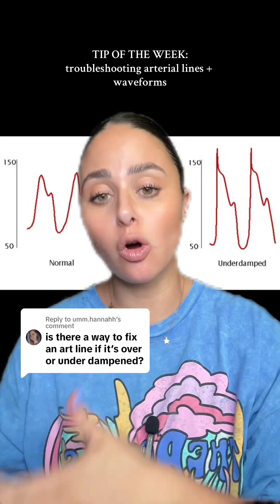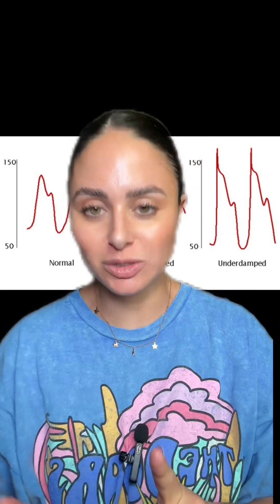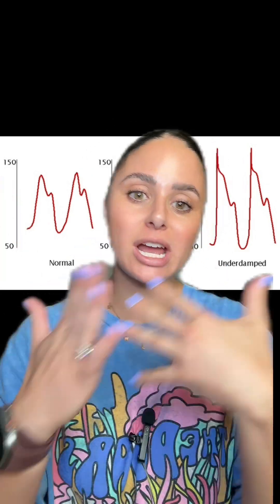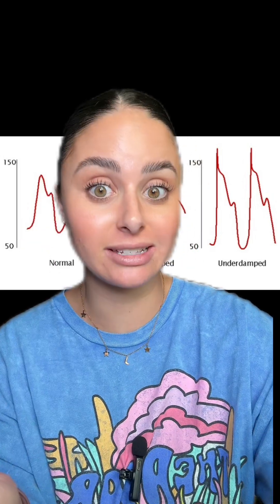Is there a way to fix an arterial line if it is over damped or under damped? Yes, most of the time. For this week's tip of the week, we're going to be talking about art lines, how to tell if they're over damped versus under damped versus a normal waveform, as well as some troubleshooting fixes.